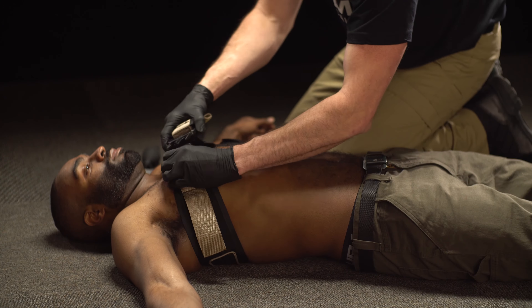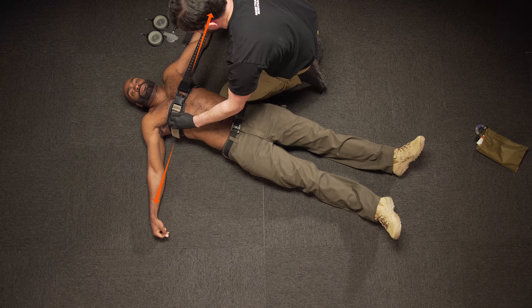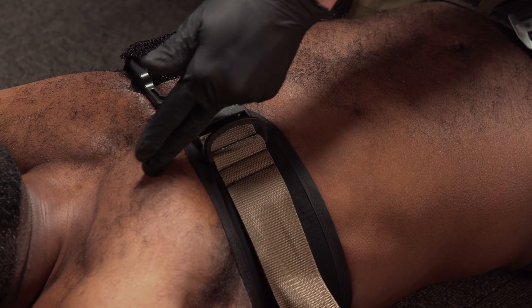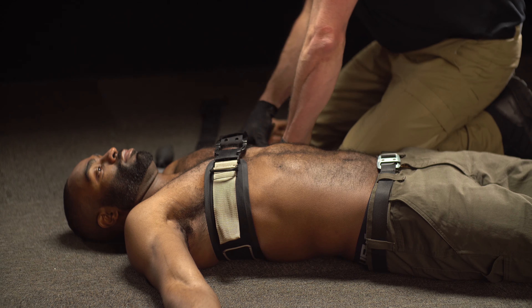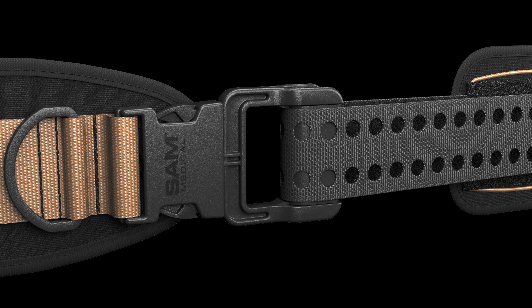Apply the SJT around the patient's chest and as high as possible under their arms. Connect the belt using the Fast-Tex buckle, then pull the brown handles away from each other until you hear and feel the click of the AutoStop buckle. Ensure that the plastic D-ring is on the injured side of the patient, aligning with the side of their neck. While maintaining tension, immediately press the precision strap down onto the Velcro surface of the SJT to secure it in place. Don't be concerned if you hear a second click after the precision strap is secured — the correct force will be maintained.